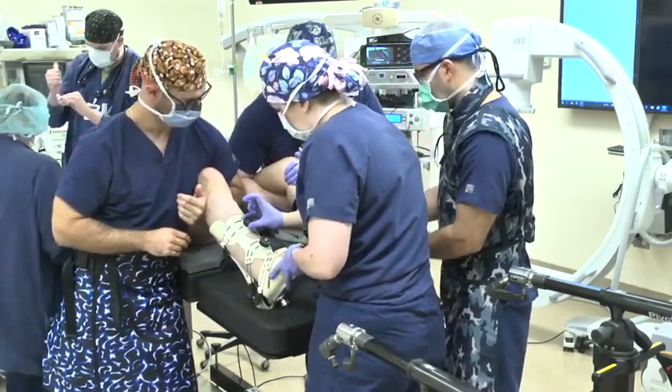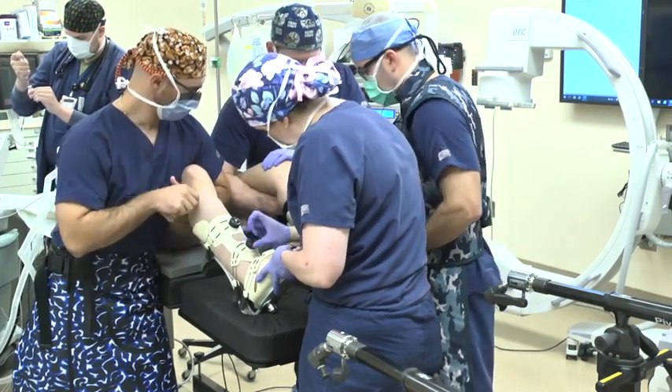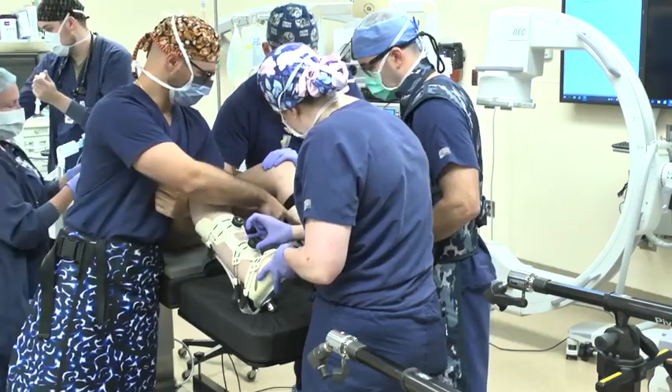To assist with getting the heel deep within the traction boot, the knee is flexed to relax the triceps surae. The operative leg is placed in the traction boot and tightened to maximum tightness while pinching the dial with only the pinky and the thumb.